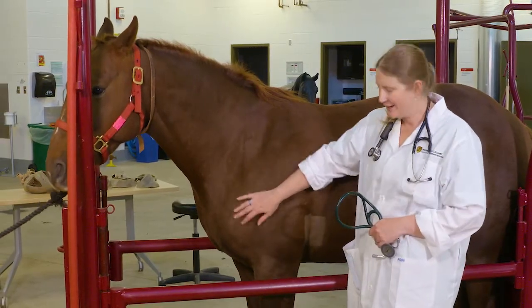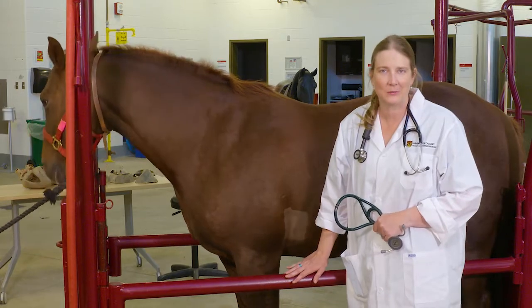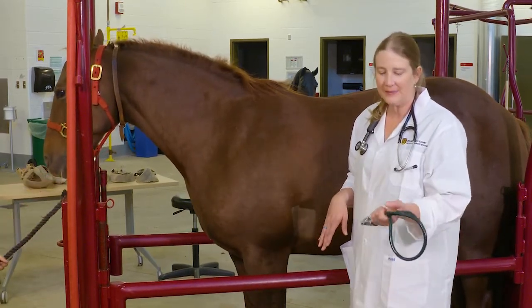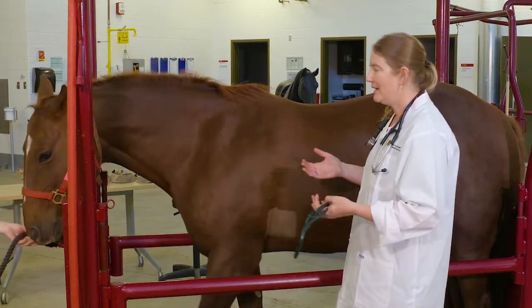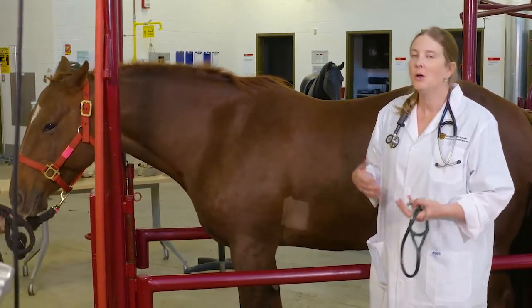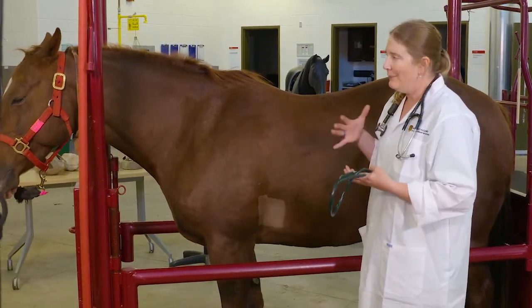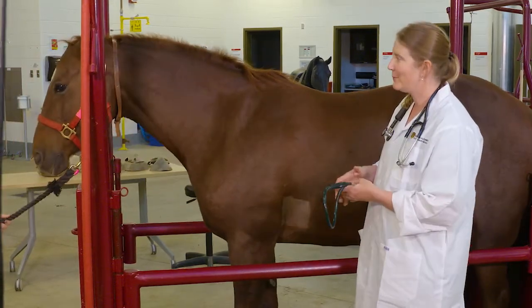So we've moved over to Daryl here. First thing we're going to talk about is listening to the heart. As a horse owner, we do recommend that you try this because it can be very helpful in an emergency situation for you to be able to take the horse's heart rate. It's valuable information to give the veterinarian who may be further away. Practice is key in knowing what's normal for your horse — so practice beforehand.